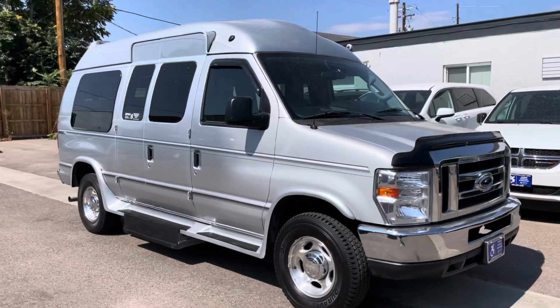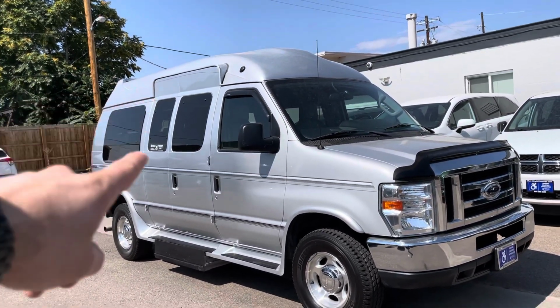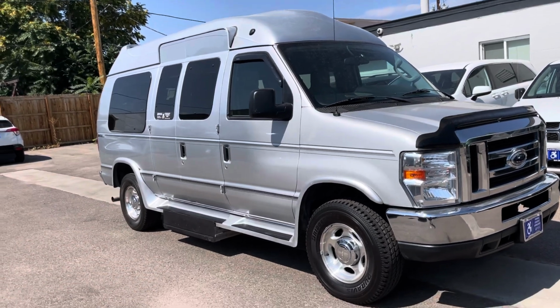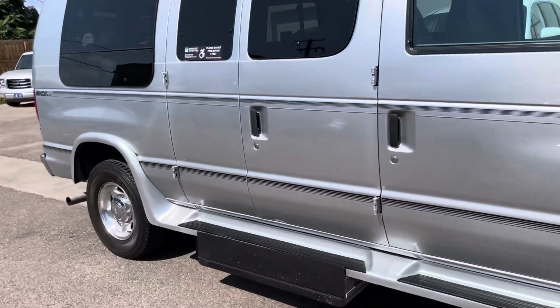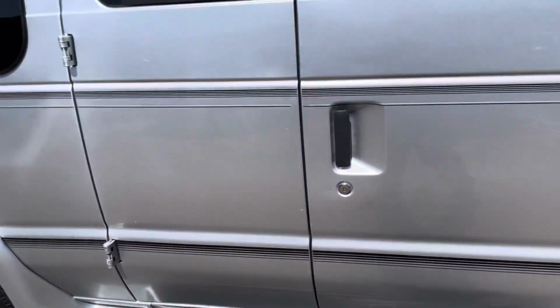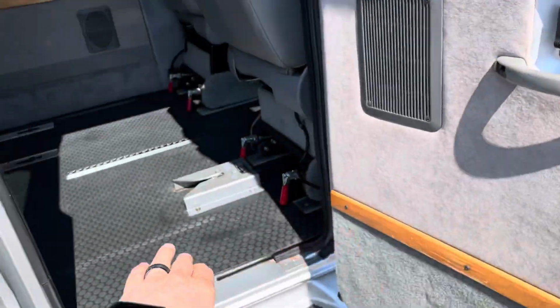This is an 8-foot tall setup. It's got the raised roof with the raised doors, and this is also lowered floor. So we have 61-inch opening height at the door, which is really convenient for wheelchair use. Okay, so I have the vehicle running, so I'm going to open up the doors.